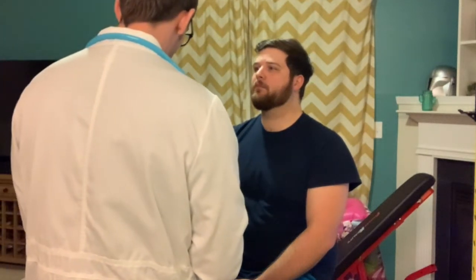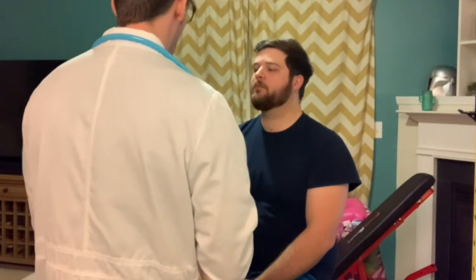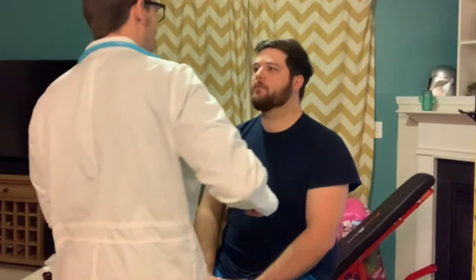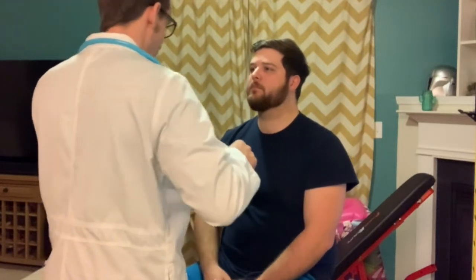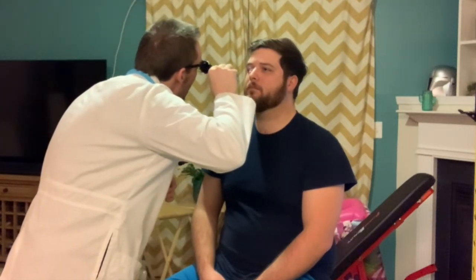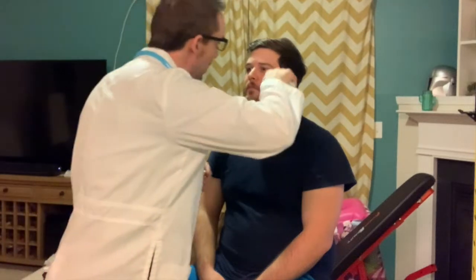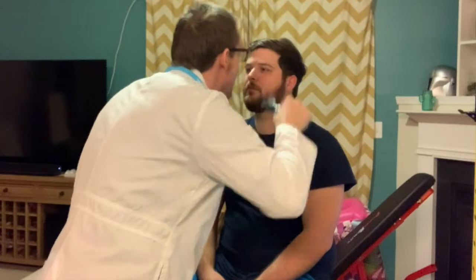What I'll do is with my right eye, look at your right eye for what's called a red reflex, and then with my left eye to your left eye. So what I'm going to do is step here, and then shine a light in your right eye, and positive, and then left, and it's positive. So red reflex is present in both eyes. Shut my light off here.